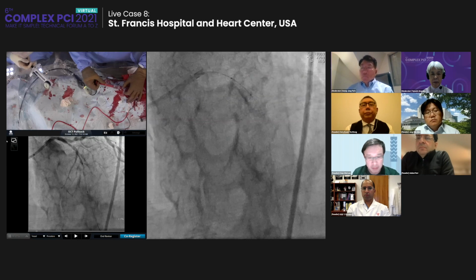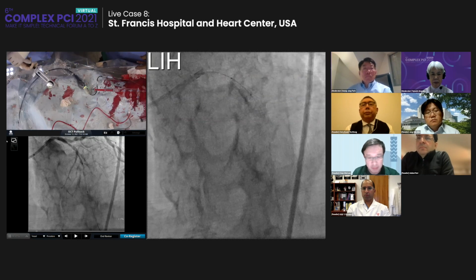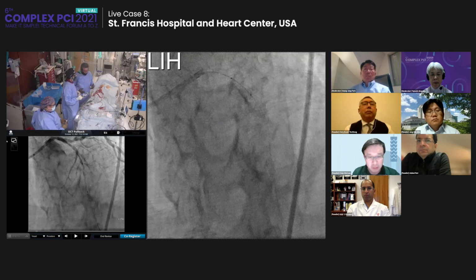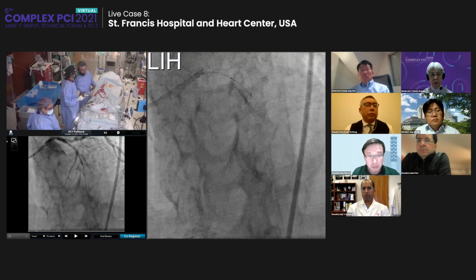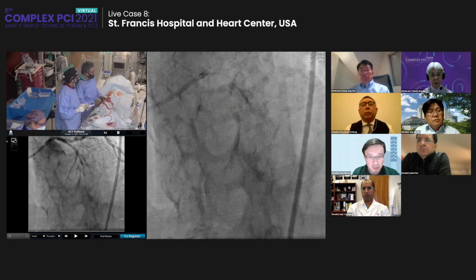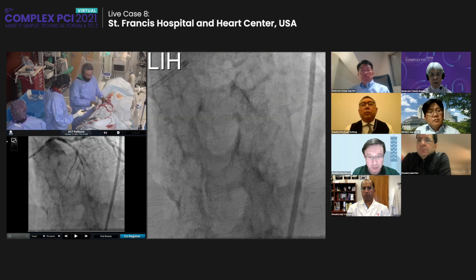So we've delivered 60 shocks, and one question is, how do you know when you're done? And the answer is after you image. So I personally, if I've done my pulse management where I think I am, and I see expansion, I leave 20 pulses left, so I could go back in if I had to. As you pointed out on the panel, it may be more difficult once you have used the balloon to get across, but I like to have some in the bank. And I think we're going to image and see what we have.